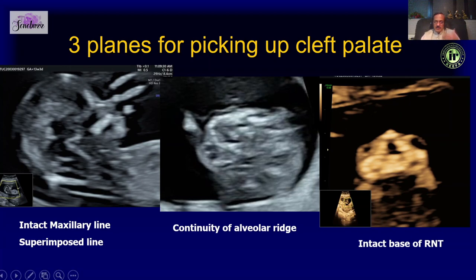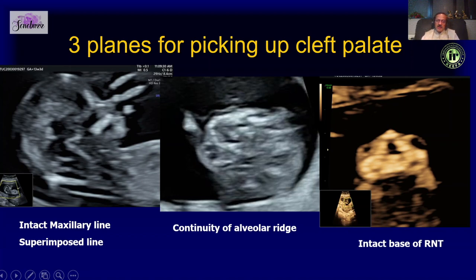The second sign in the sagittal view is the superimposed line sign described by Dr. Lakshmi from India. If you look carefully, you see two lines at the palate — one on top and one which is the basic palate. This area is formed by the vomer bone, which is superimposed on the palate, and she has labeled this as the superimposed line sign.